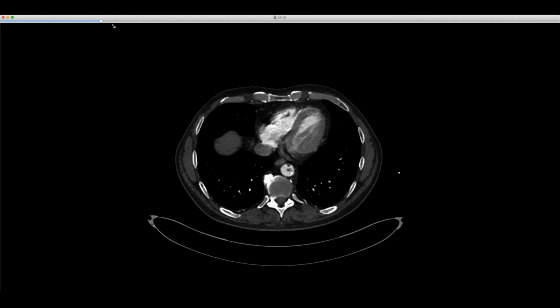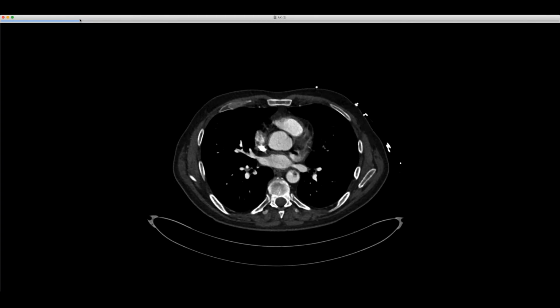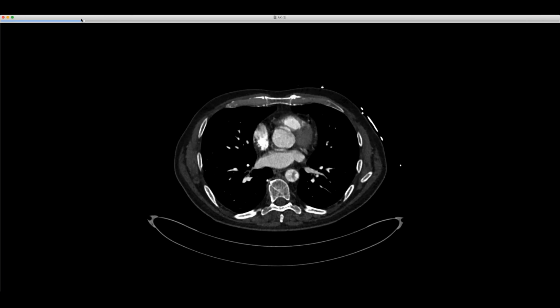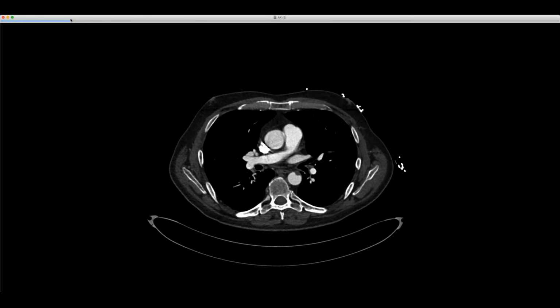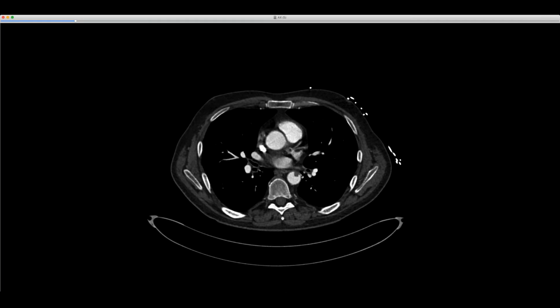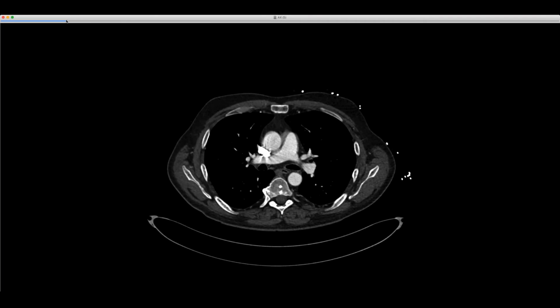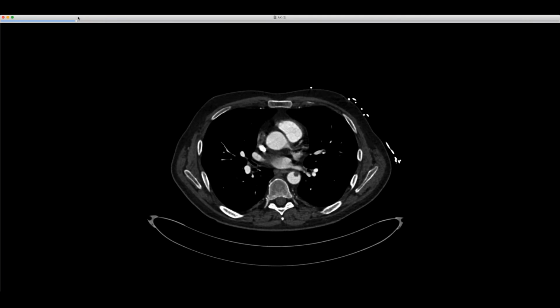So Brent, was there any source of these thrombi more proximally, such as the left atrial appendage or something like that? No, this was secondary, not primary. We didn't see anything in the left side of the heart, in the atrial appendage, or the rest of the atrium. It looks like there might be a lead point, some atherosclerotic disease there or something. We see that as a lead point sometimes. But we didn't see anything that was causing this. It was just a free-floating adherent thrombus.